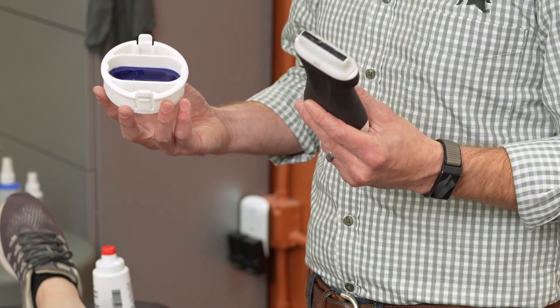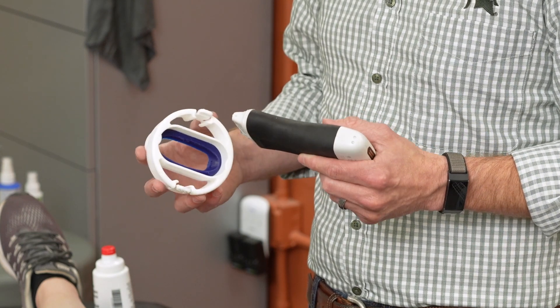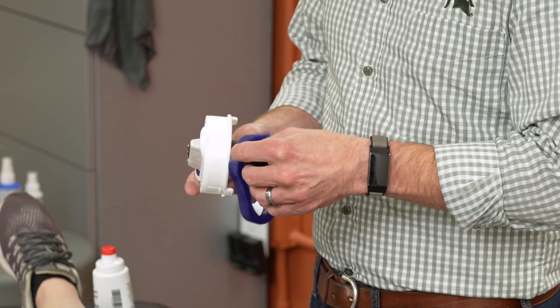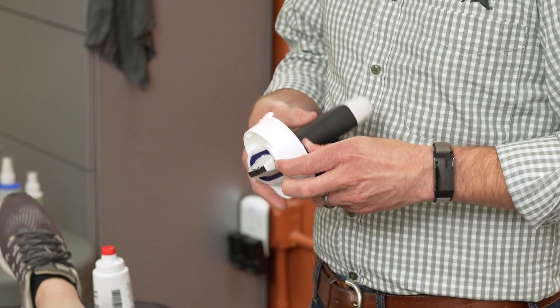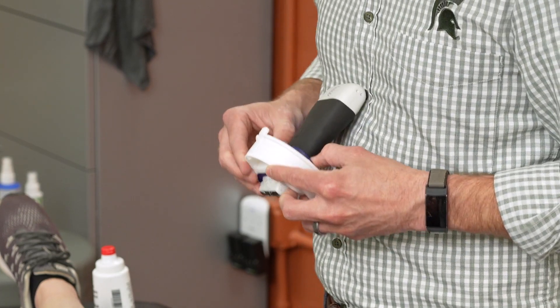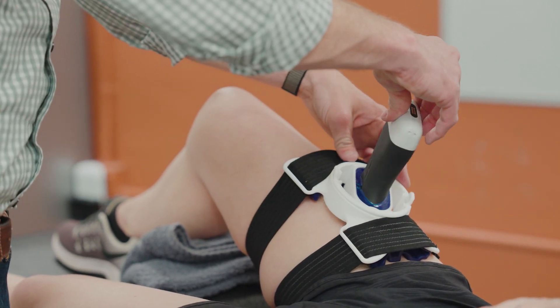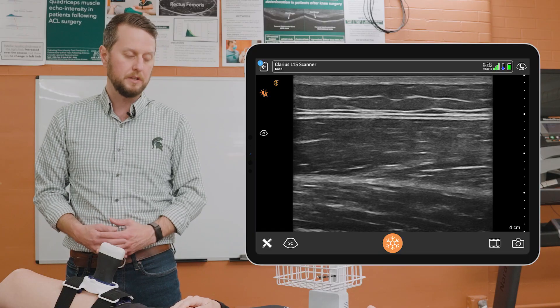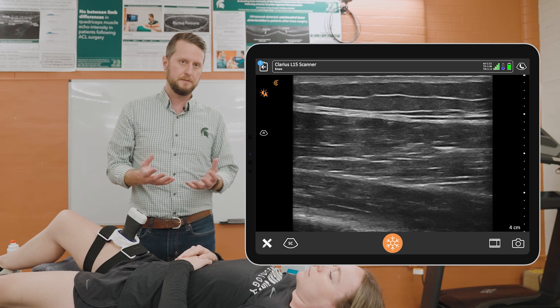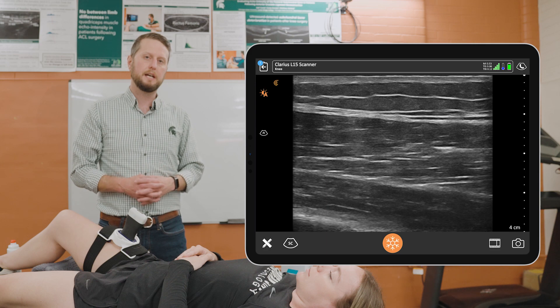Now with the base of our USONO probe fix onto the leg, we'll secure our Clarius scanner into the probe holder of the USONO that's built specifically for our Clarius scanner. We enter it into the hole and affix the other piece of the probe holder, securing everything onto the skin. We now have the ultrasound probe secured and can have the participant move on to doing whatever physical activity we want, so that we can dynamically monitor that muscle during that activity.